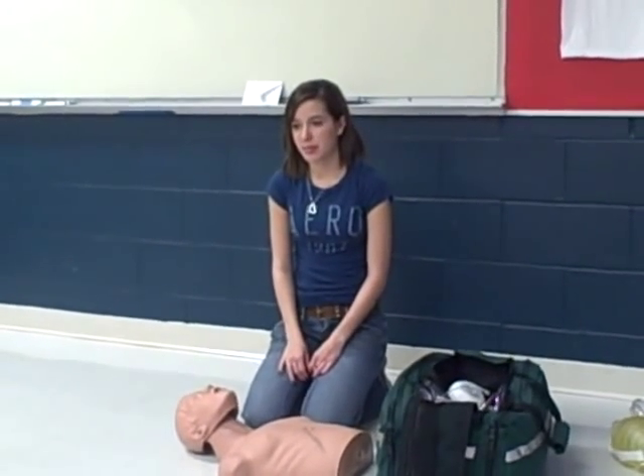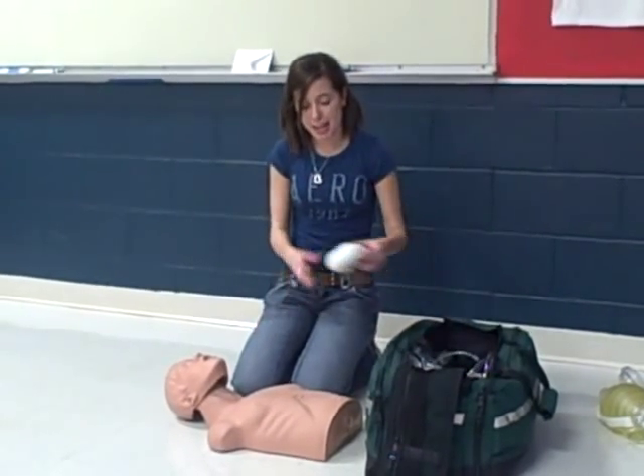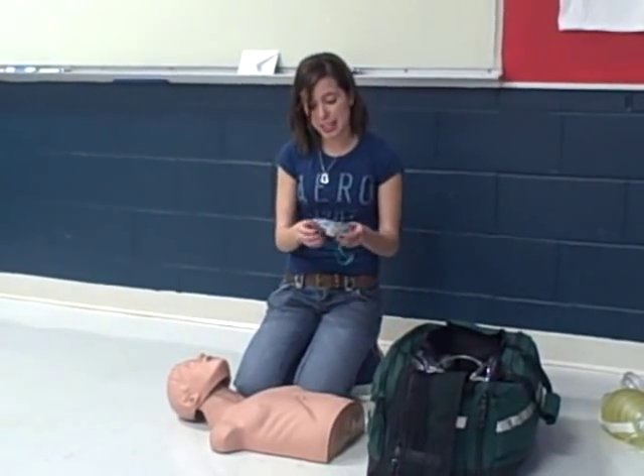You will be performing your mouth-to-mask with supplemental oxygen. You may begin. BSI for my buddy and I. I will get my pocket mask and see if it has a one-way valve on it. This one already has one connected permanently.